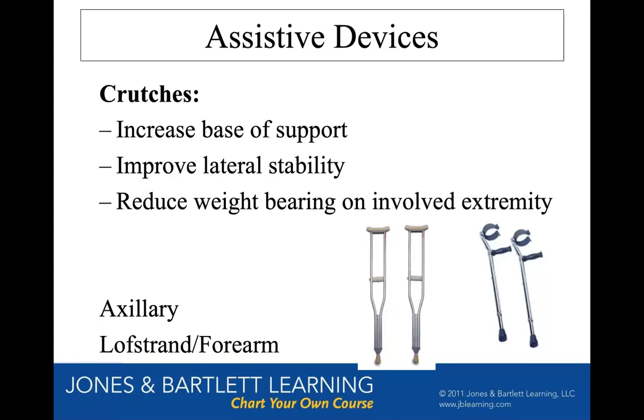You'll see a lot of spinal cord injury and CP, like maybe kids with CP and adults with CP, using these kind of crutches more. People that are older and have polio or post-polio syndrome may have Lofstrand crutches, but not seeing that often. But they do have a place. Axillary crutches are almost always used for short term.